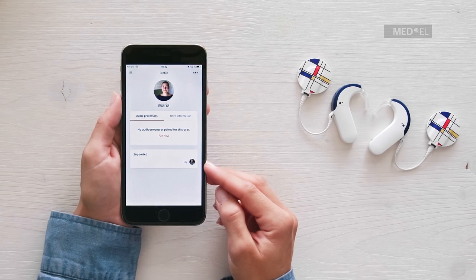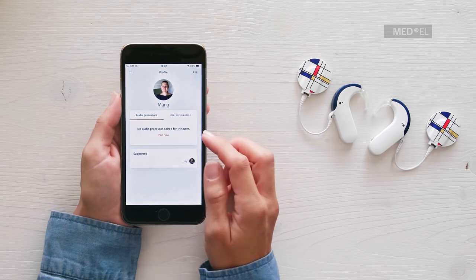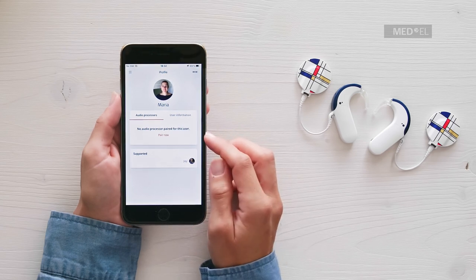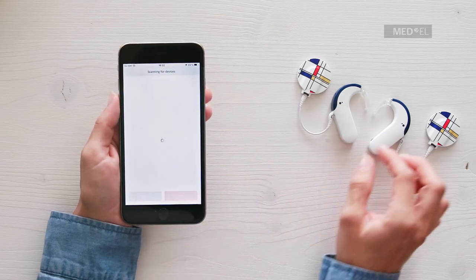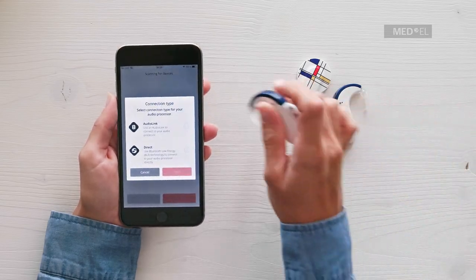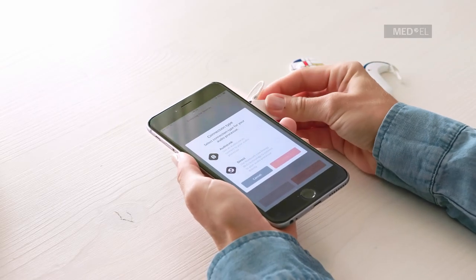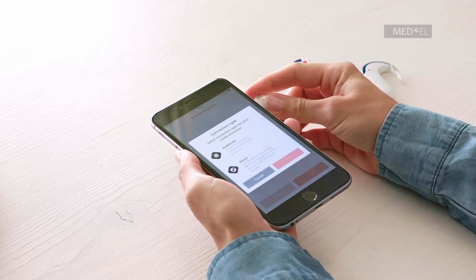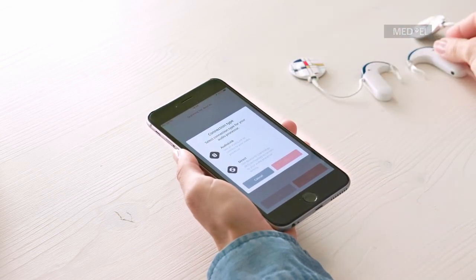To become a guardian, first pair the processors you want to control. Go to your profile and tap Pair Now. Select the connection type and tap Next. The audio processor will pair automatically to AudioKey.